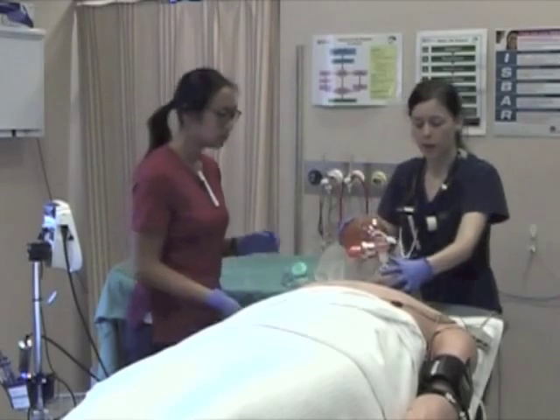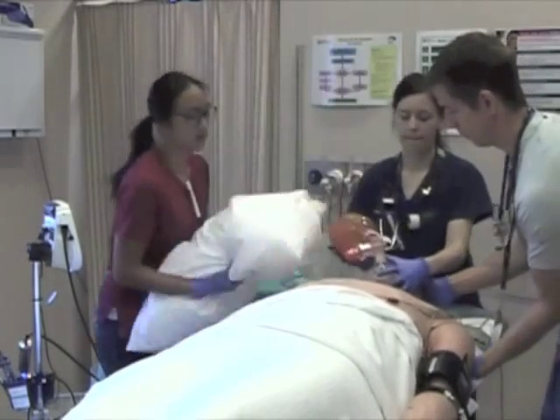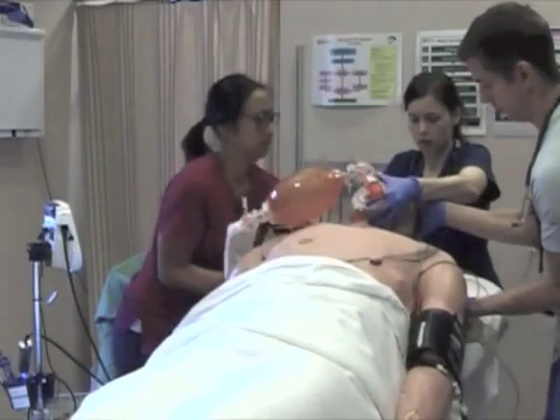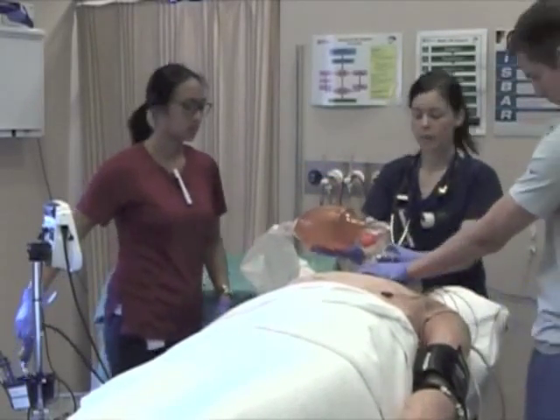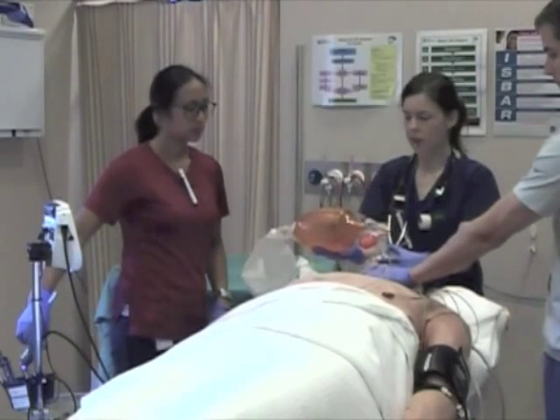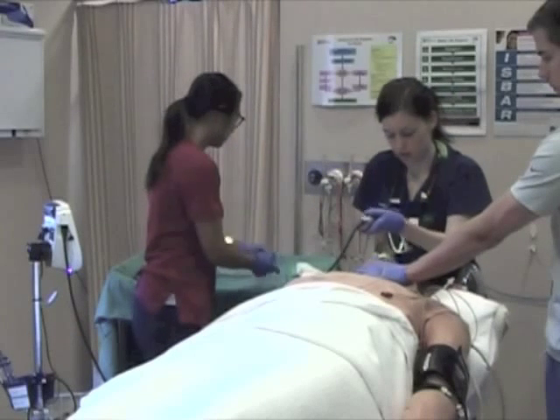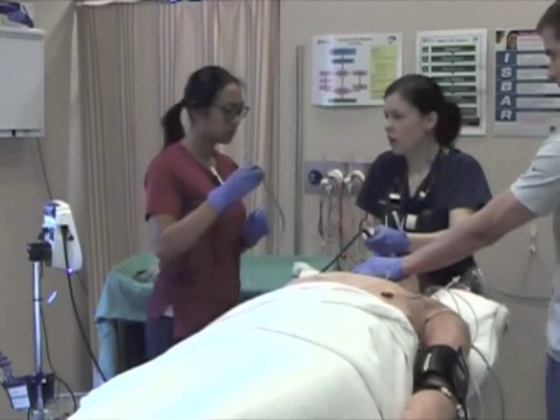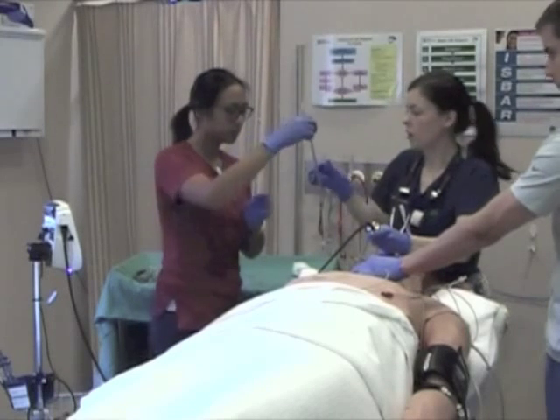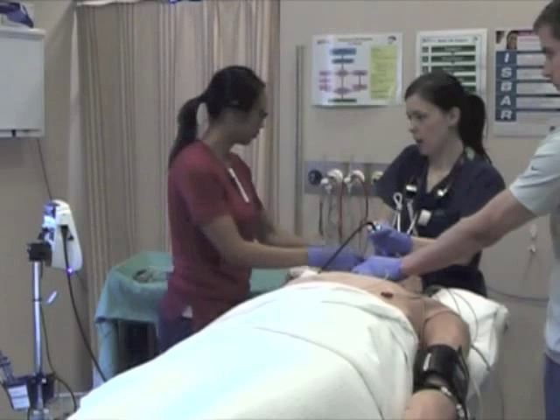Jenny, if I can get your help putting a pillow just under him. Yep. Nice. Wait, 1, 2, 3. Great, good. And Tim, you can provide some laryngeal manoeuvres as well. Yep. And then we're going to start having another look again. Great. Thanks. Good, so good. Seeing a good video view. Grade 1 on the video. And we're passing between the cords.